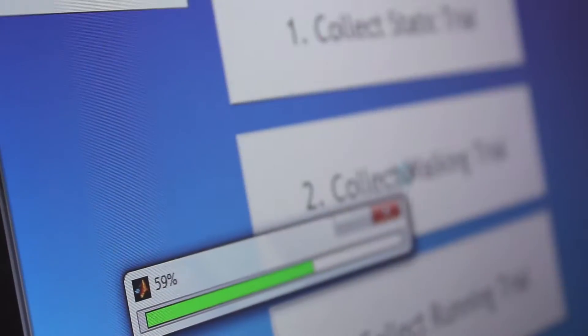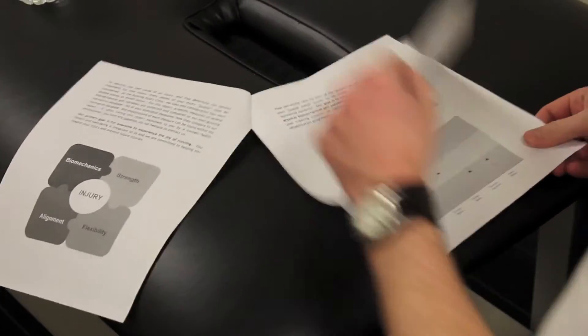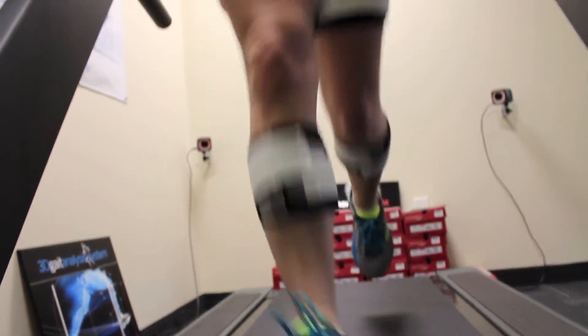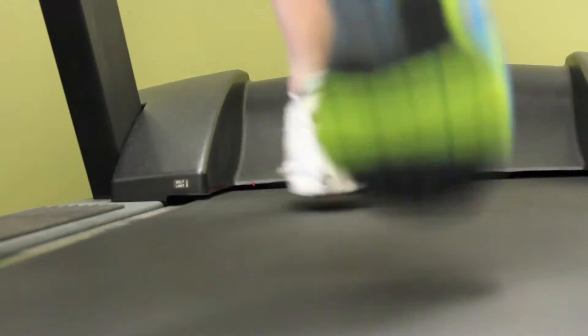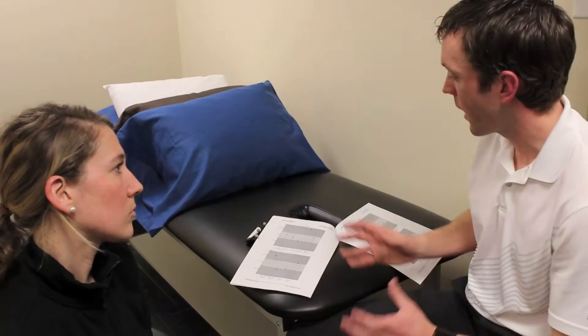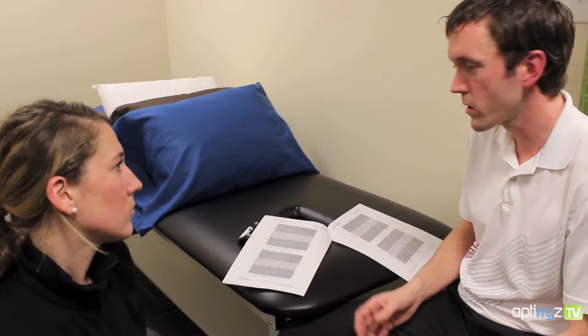The data compiled from the markers will be put into the computer system, which will help generate a report like this one. This gives us an injury index — a score of what's going on in your body at the different joints — so we can look at what the ankle, knee, hip, and pelvis are doing. We get an even further breakdown of the different joints, telling us the angles and movements occurring, whether they're ideal, excessive, or reduced. This helps us focus on an exercise program to fix those subtle problems and get you back running without any pain.